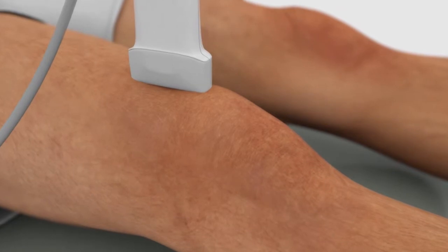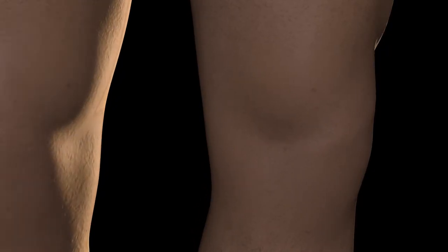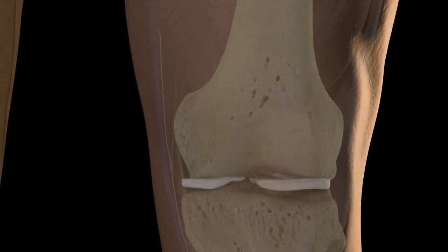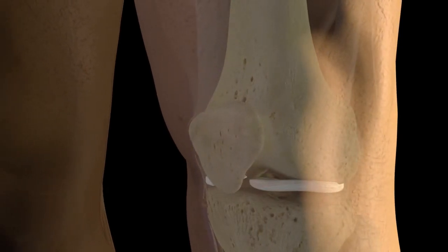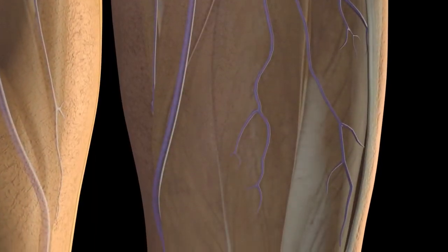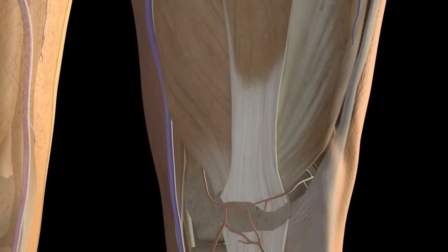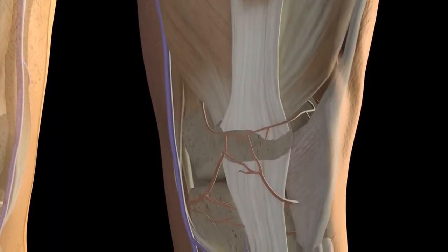With the probe marker pointed proximally, the knee includes the condyles of the distal femur, proximal tibia, and the head of the fibula. Anterior to these structures is the patella. The 4 tendons of the quadriceps muscles join to form the quadriceps tendon. At its inferior end, it is attached to the patellar ligament.